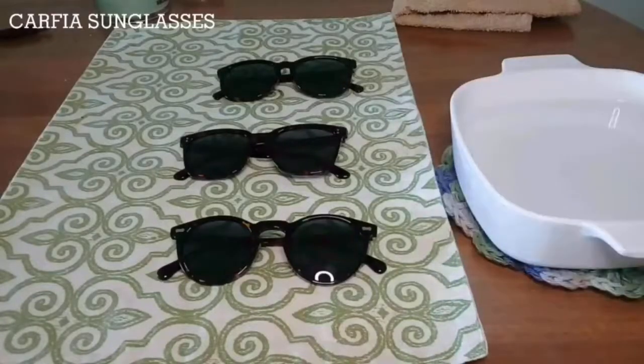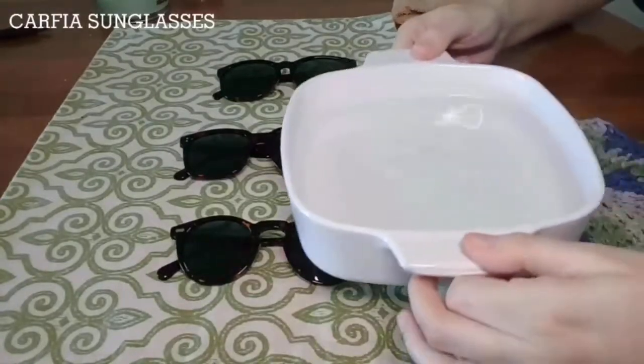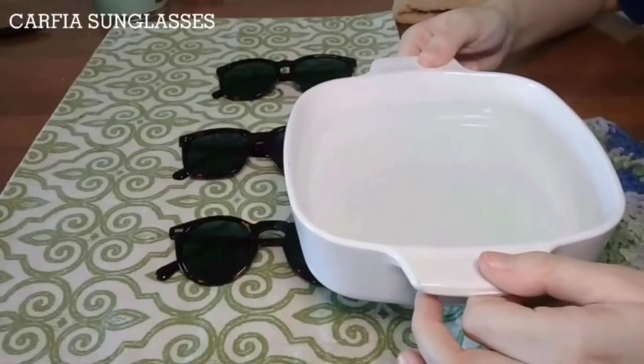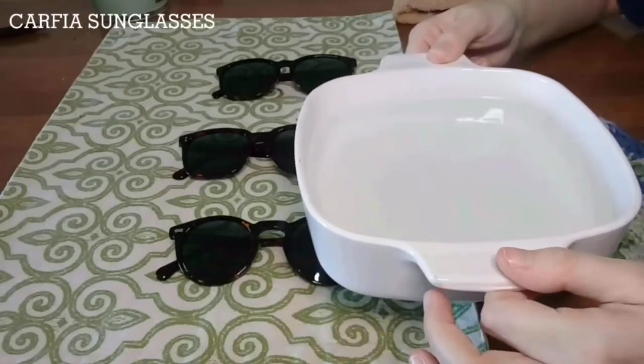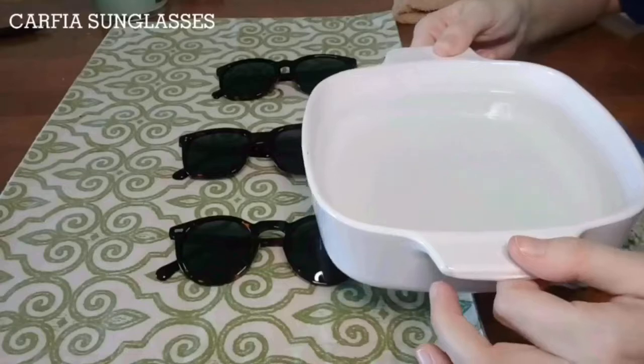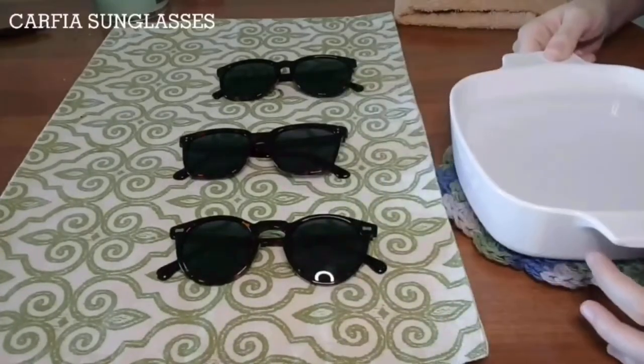So I have all three pairs here with me, and I also have my supplies that I'm going to need, which is my bowl of hot water. I'm again using this little casserole dish. I have brought this water to a boil in the electric kettle, and then I've let it cool for about 5 minutes before I poured it into the dish. And then as it sits here, of course, it's cooling off a little bit more.